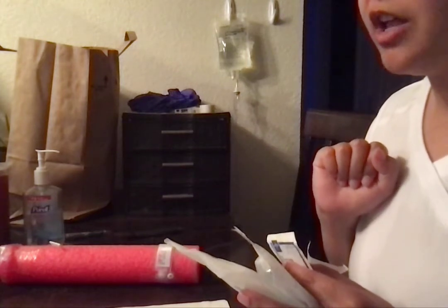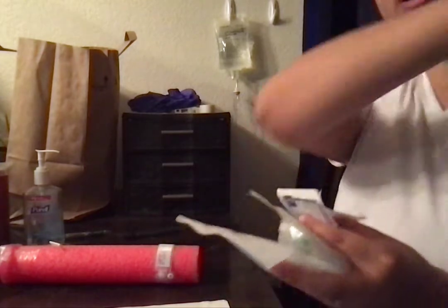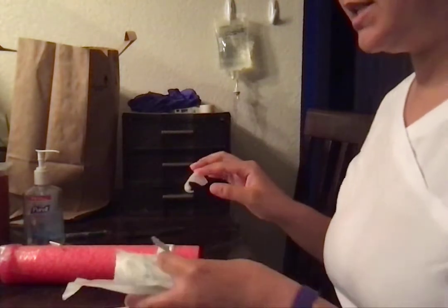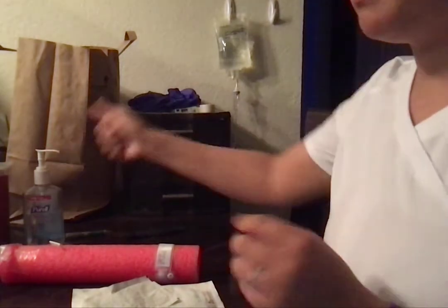So, knock, knock, knock. Hello, Millie. This is Angel, your Excelsior College student nurse. Is it all right if I come in? Yes? Okay, I'm going to go ahead and pull the curtain and I'm going to wash my hands. I'm going to put everything here on the side table. And I'm going to wash my hands.